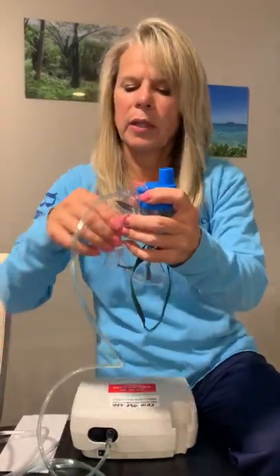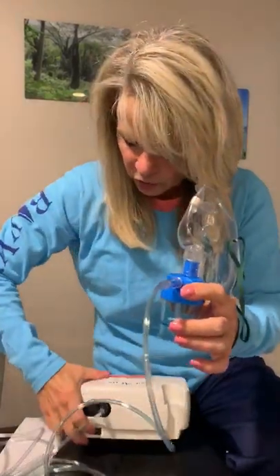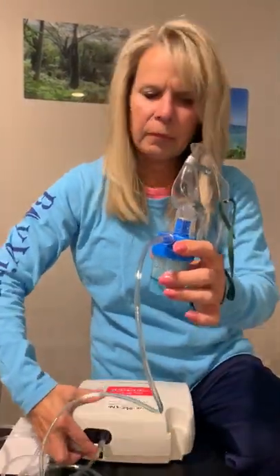I will demonstrate with this. Then you're going to put the face mask back on. You're going to turn the machine on at the bottom, and you will strap this over your face.